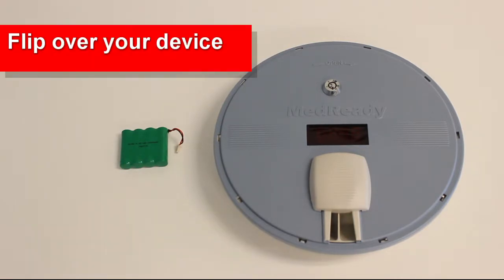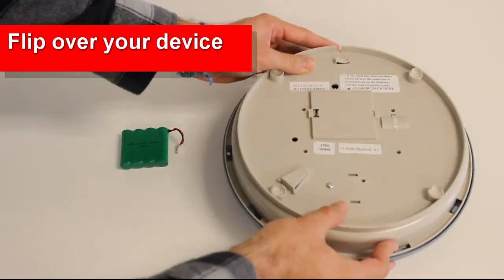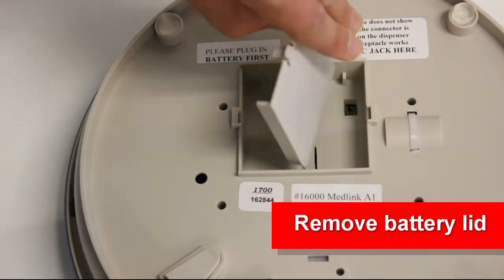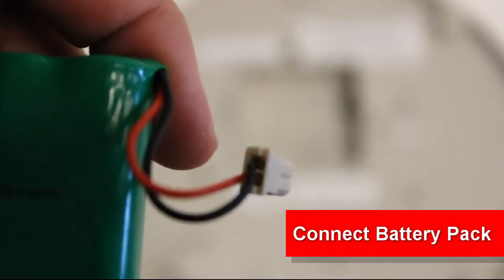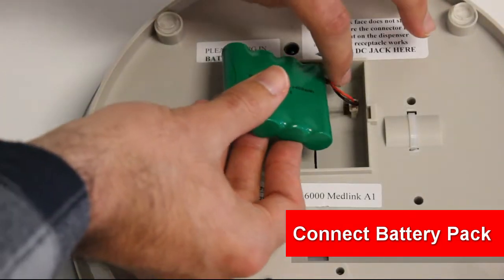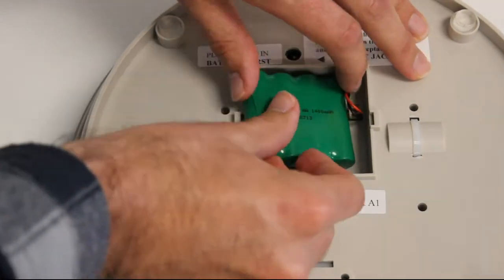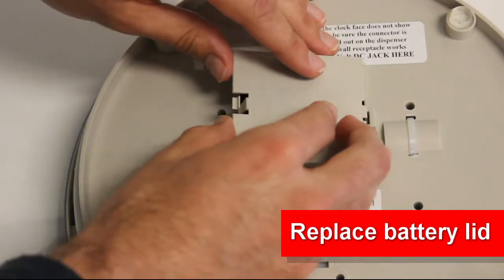Step 1: Connecting the battery. Start by flipping over your device, then remove the lid. Now grab your battery pack. Notice the small wire coming out of the corner and plug it into the hole in the back. Once plugged in, lay the battery pack horizontally like so and replace the lid.